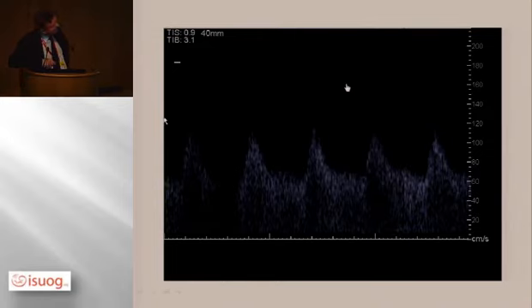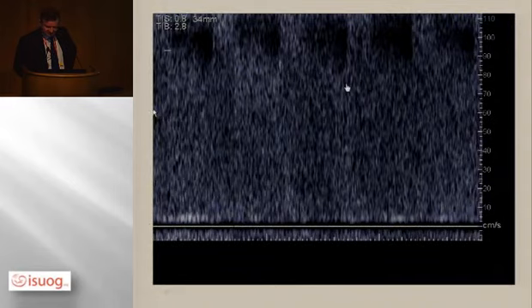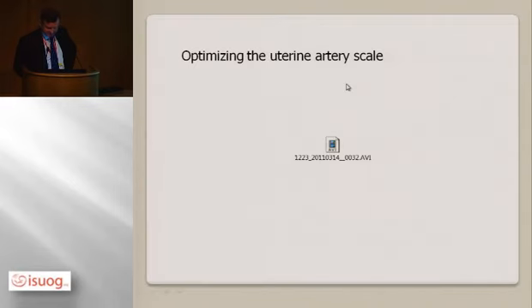So you can tell a measurement here, if you manually measured, you'll be able to trace pretty well around that. An auto measure on any machine also depends on the quality of the waveform. Auto measure would work very well on that, whereas it might not work so well in, well, it'll work in that image, it certainly won't work in that image.